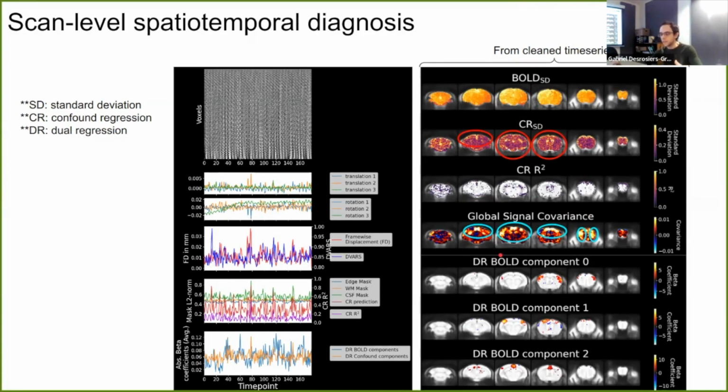It's a way to assess what the global signal is specific to, where it loads the most. In the case of a good quality scan with clear network activity, it tends to load in the cortex, in gray matter regions, as I'm highlighting here, with features that are reminiscent of certain brain networks. And that's usually a very good index, if you see this, that your scan is minimally corrupted and has nice network activity.